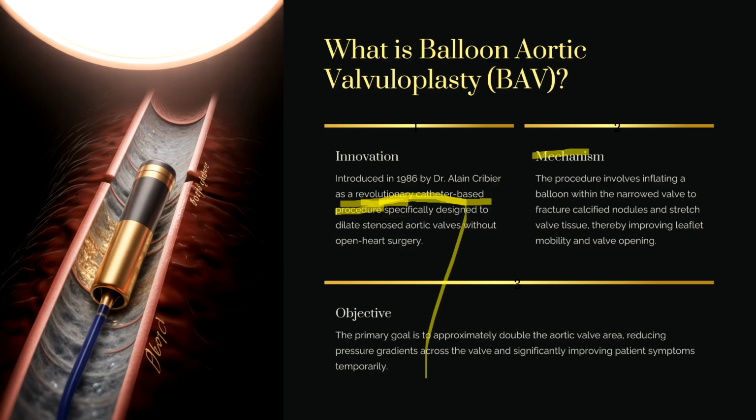Now, what is the mechanism behind this? The procedure involves inflating a balloon within the narrowed valve to fracture calcified nodules and stretch the valve tissue.